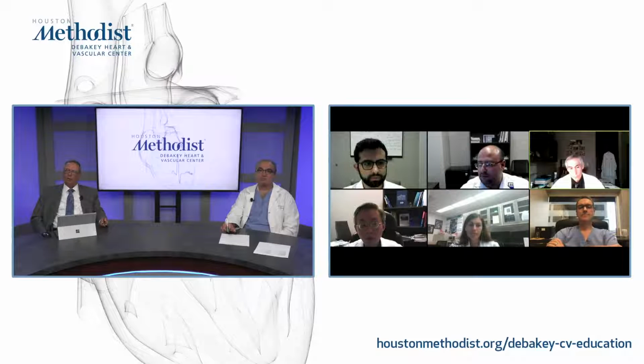There may be an occasional nice case with the TEE that you show in every conference because you can see the clot. But the truth is that on a majority of patients, the CT has really become the main workhorse for assessing these patients. So great case.